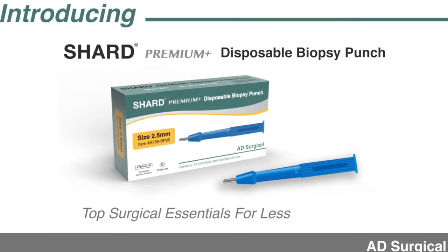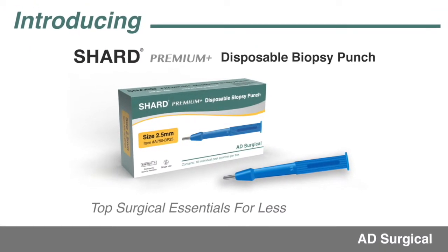Introducing Shard Disposable Biopsy Punches — Top Surgical Essentials for Less.